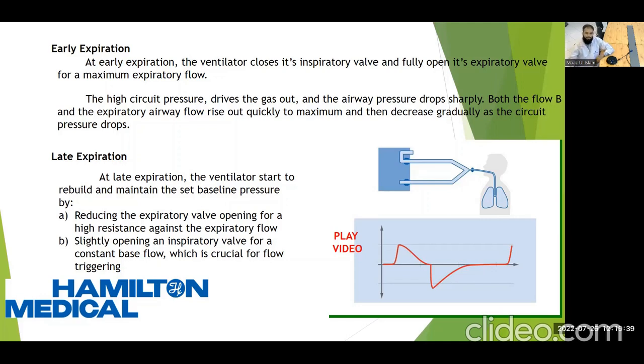The high circuit pressure drives the gas out and the airway pressure drops sharply. But the flow B, the expiratory airway flow, rises quickly to maximum and then decreases gradually as the circuit pressure drops. This is the phenomenon of early expiration where the loop decreases but not straight.